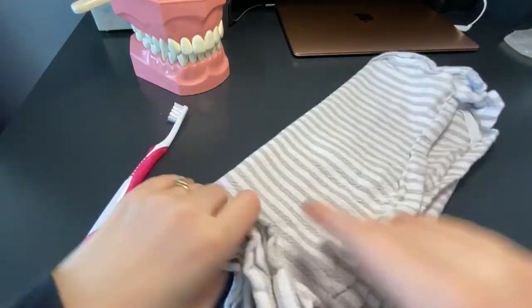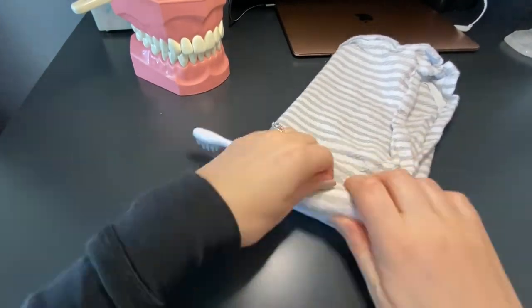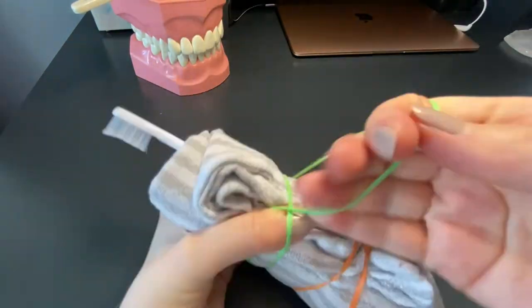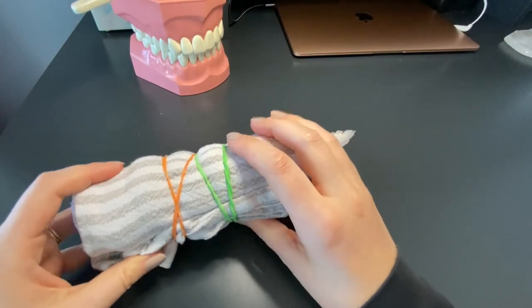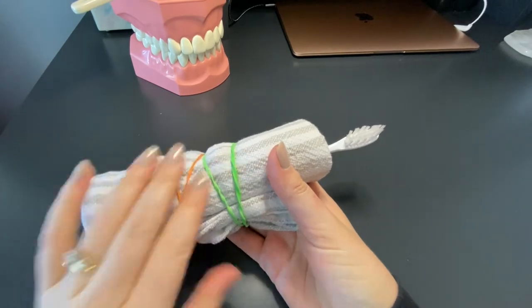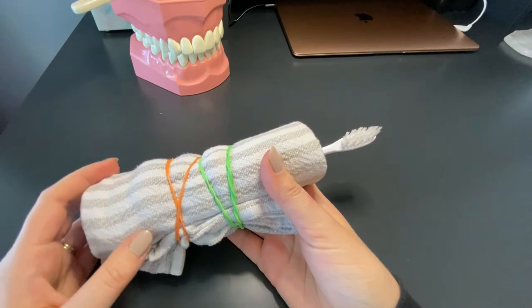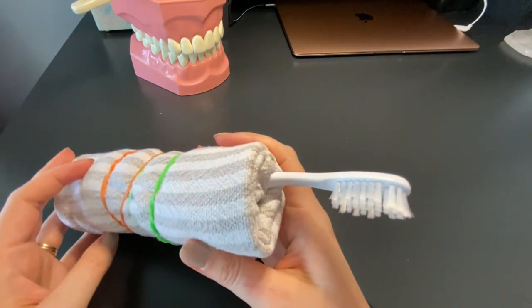Another way to thicken your brush handle is to grab a regular dish towel, wrap it around the handle of the toothbrush, and secure it in place with some elastics. The great thing about using the towel and elastics is that you can take it off after it gets dirty and just run it through the wash, then get a fresh one.